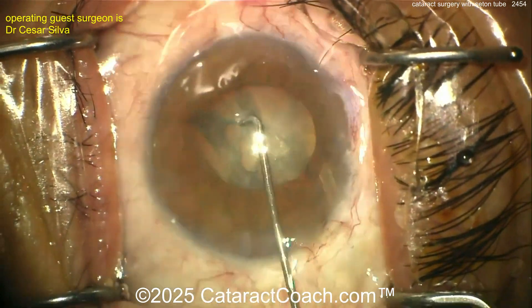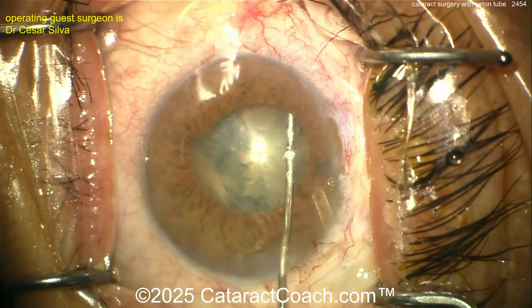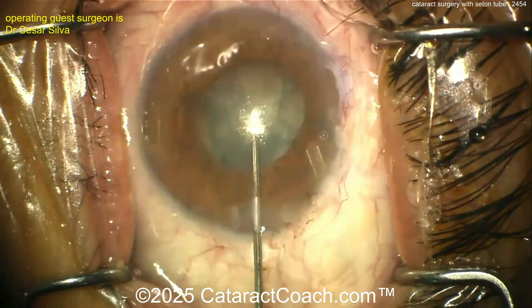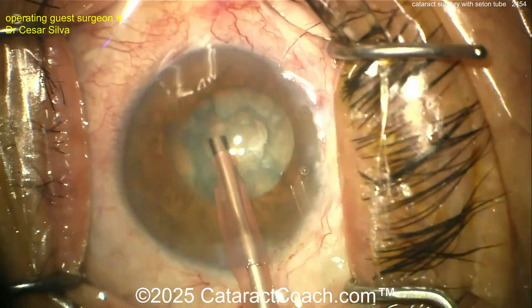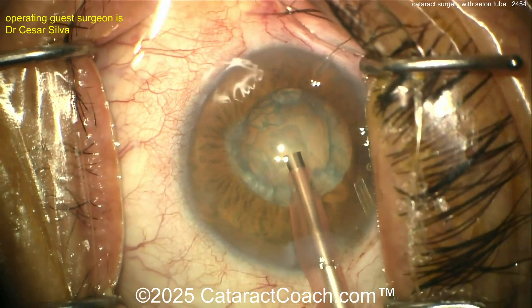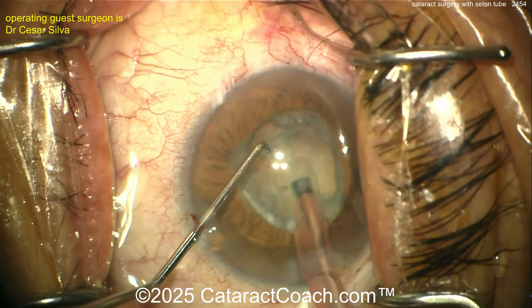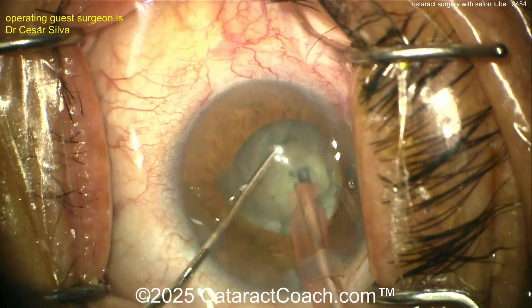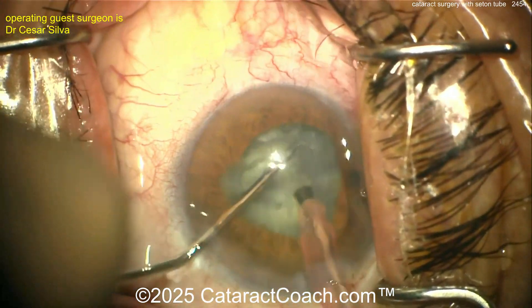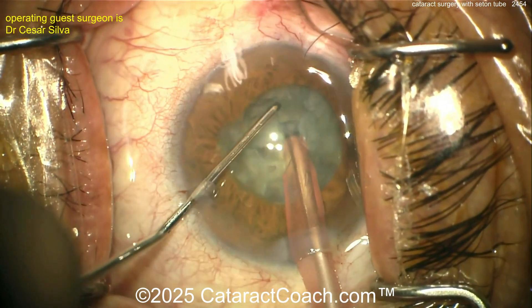What is different about having the seton tube? Think about it — in normal phaco there's one source of fluid inflow: your BSS bottle. Sources of outflow in a normal case are what you aspirate out through the phaco tip, and leakage from the incisions. In this case there's extra leakage from the main incision, the paracentesis, and even more fluid going through that seton tube — the Ahmed valve. So you've got to change your fluidic settings and be very cautious.